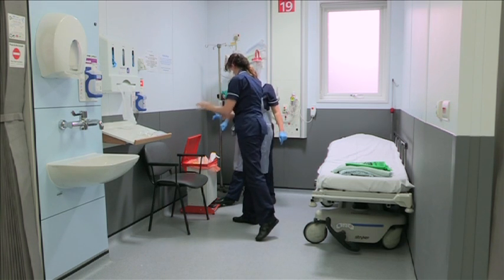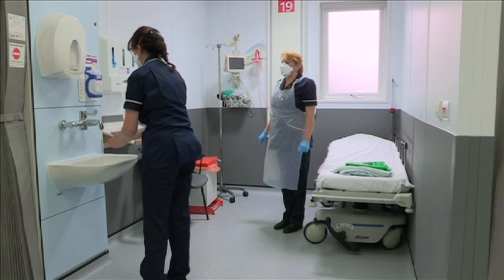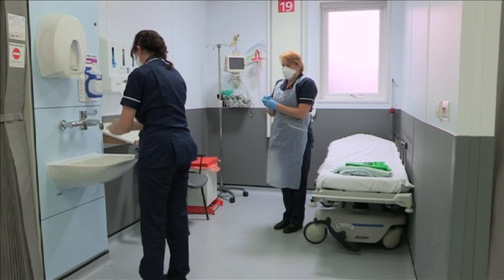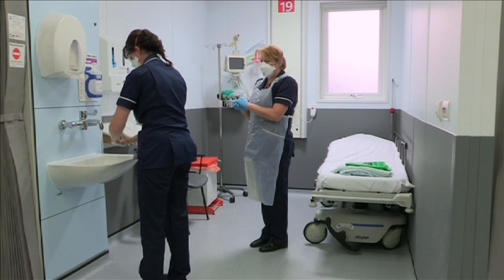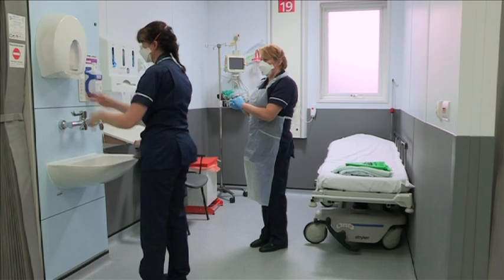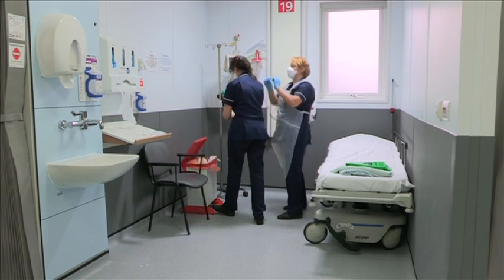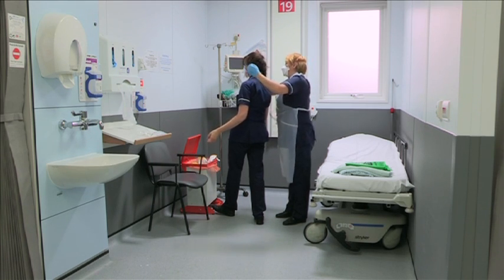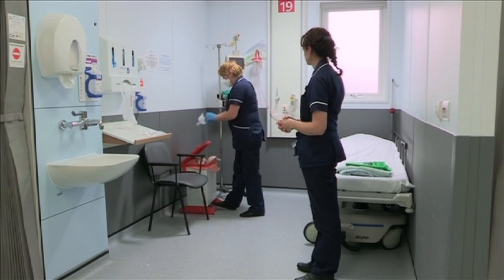Remove gloves and decontaminate hands. The buddy can then assist with removal of the eye protection and the mask, and then remove their own protective equipment.